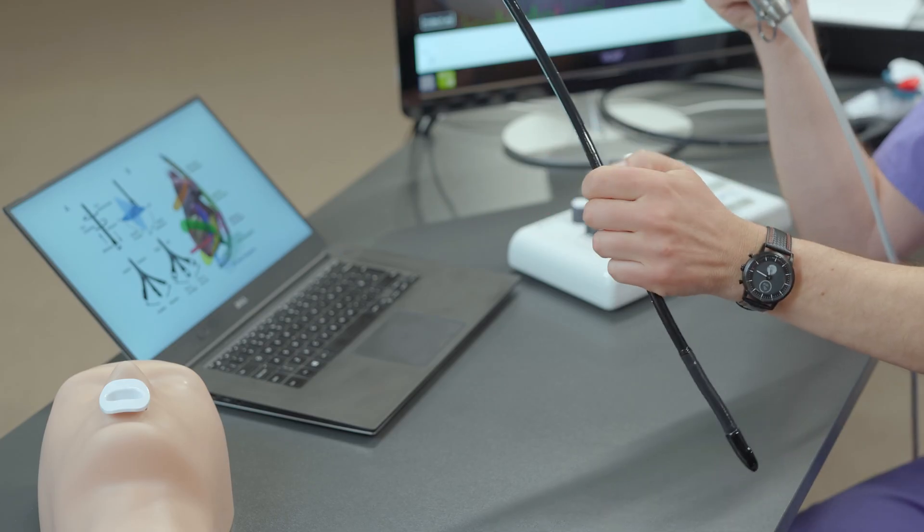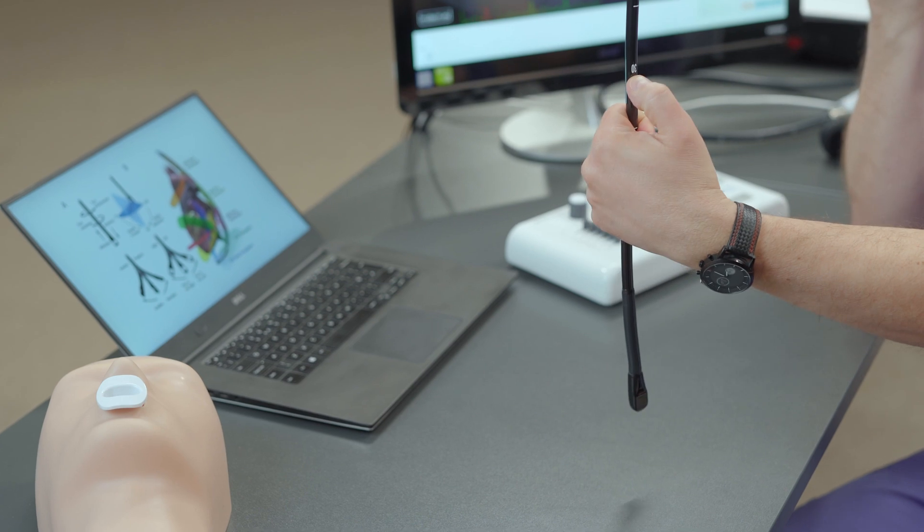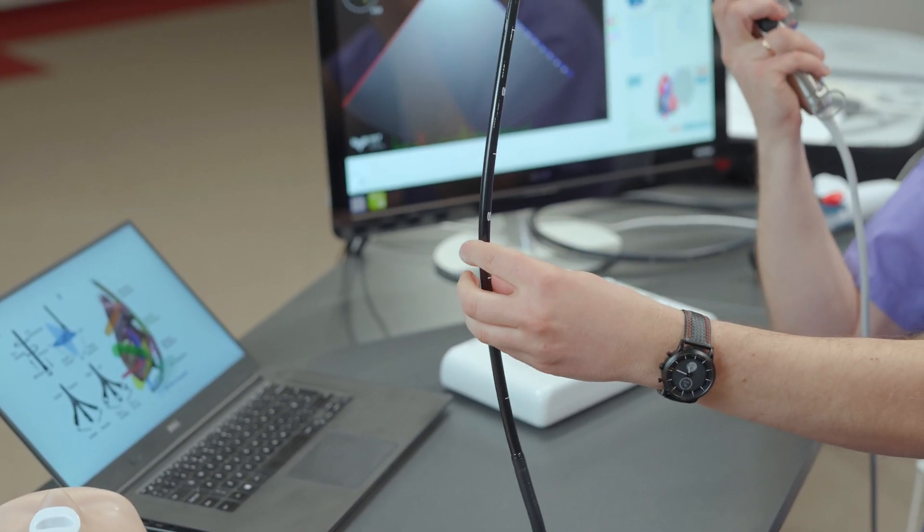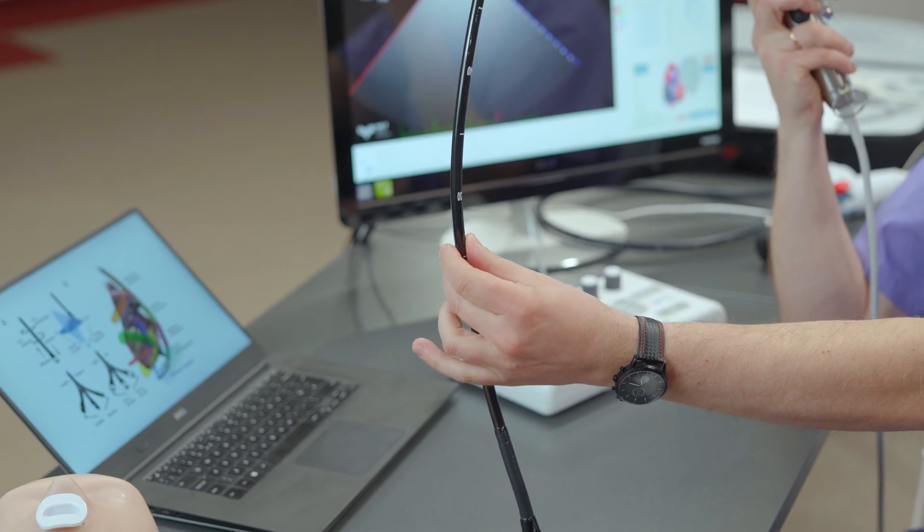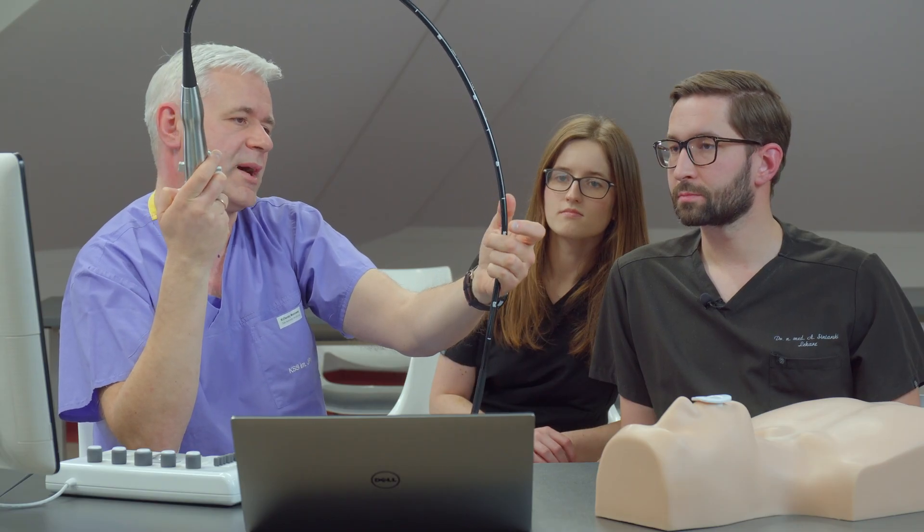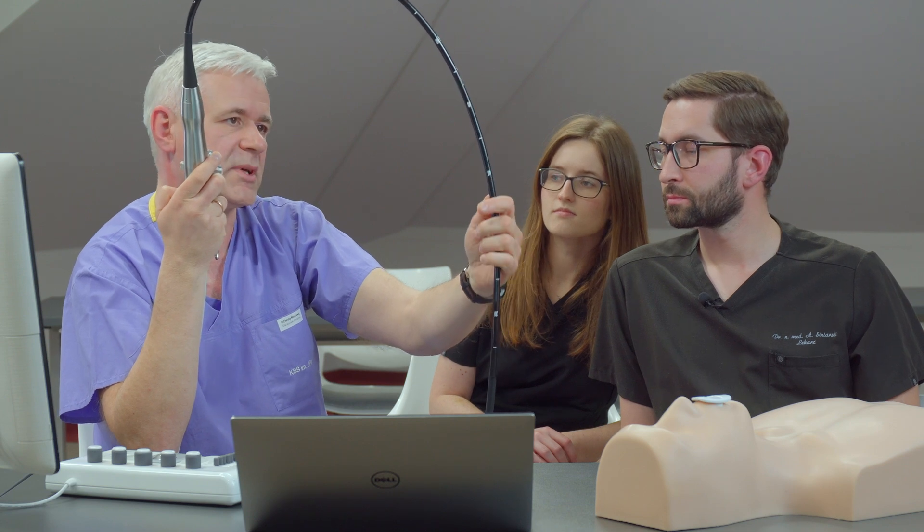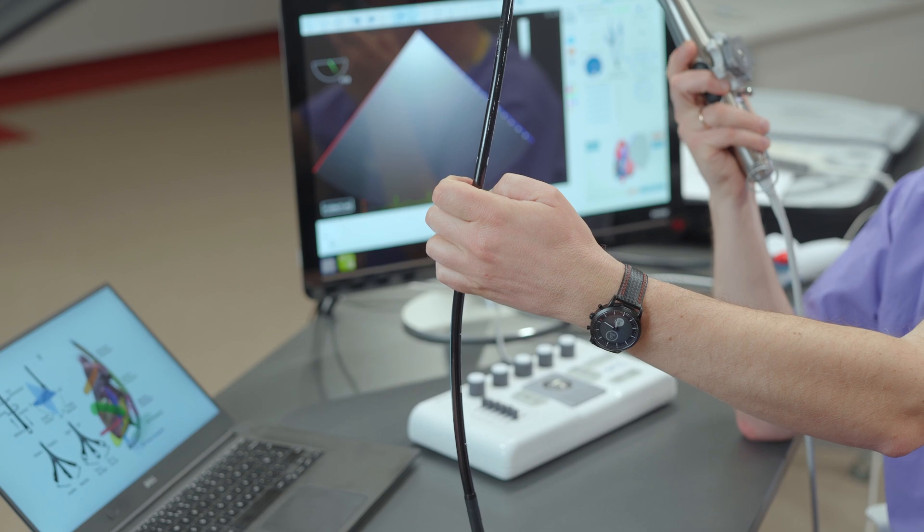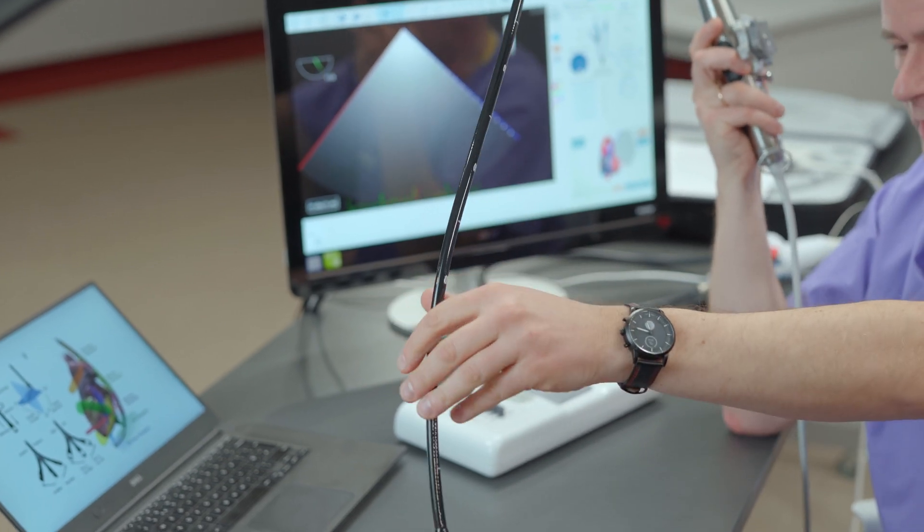You can control it by looking at those numbers on the shaft - 20, 30 centimeters. Usually the heart starts about 25 centimeters from the teeth. If you go to 35, 40, it's in the mid-esophagus. If you go to 40, 45, usually you are in the stomach. This is very helpful as well.